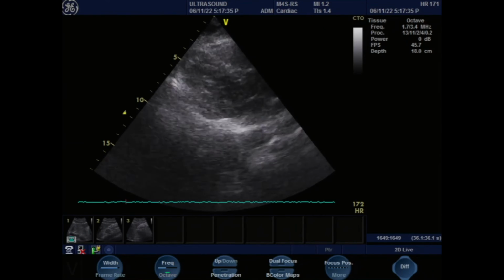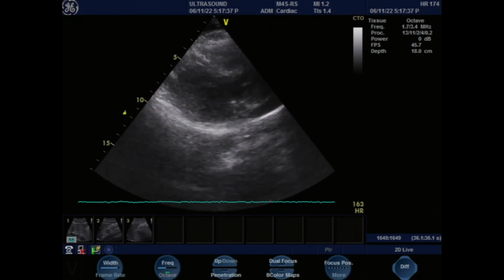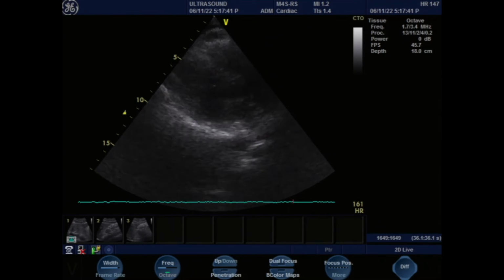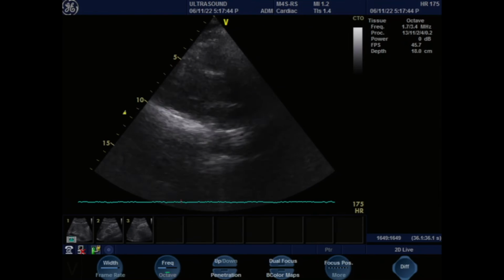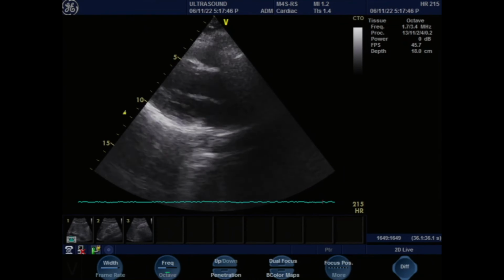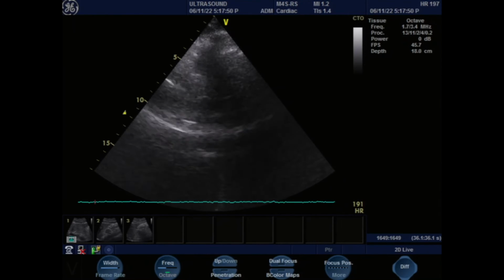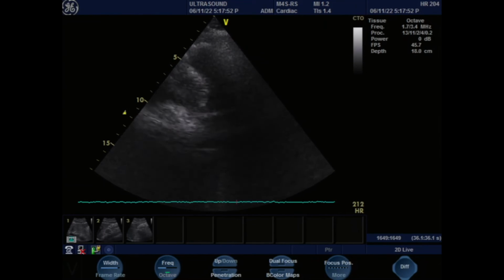Forget about it. Yeah, I mean, the good thing is that you have a great heart. You're getting it, like so many people do. You have got a right ventricle right here. And this is the left ventricle, the mitral valve, the aortic valve, the picture right here.